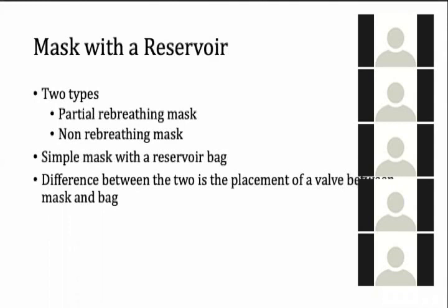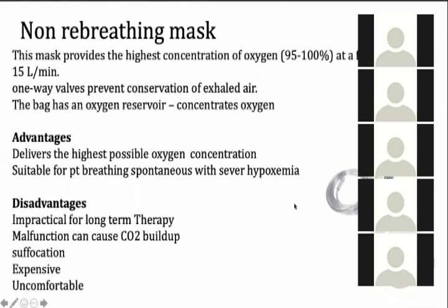And there's another mask. Sometimes you might have seen this mask where there is a large bag attached to it, like in your ambu bag. Has anybody seen this mask being used? Okay, looks like no, but next time when you go to a ward or somewhere, just ask whether they have this type of mask.